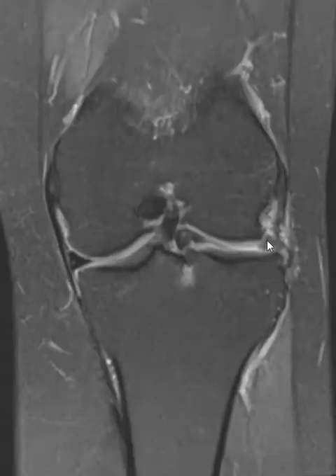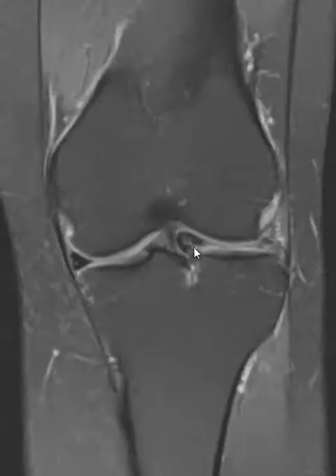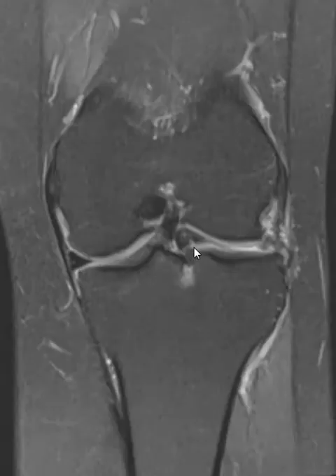The meniscus is torn from the anterior horn, the body and posterior horn, and this large bucket handle fragment is drifted into the central part. And this is just a very classic look and pretty common type of a tear. More often, I see the meniscus tear, the part that is displaced inward, the bucket handle fragment, is very small. Sometimes it's almost impossible to see or really difficult to see. And the meniscus is almost normal in morphology.